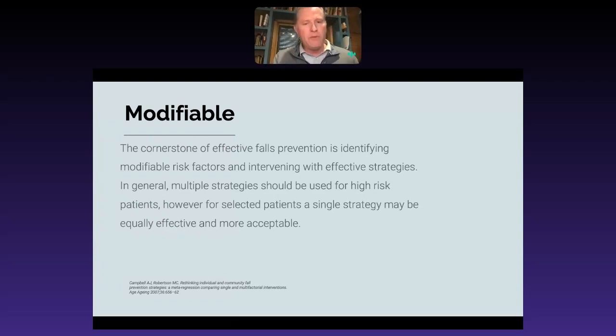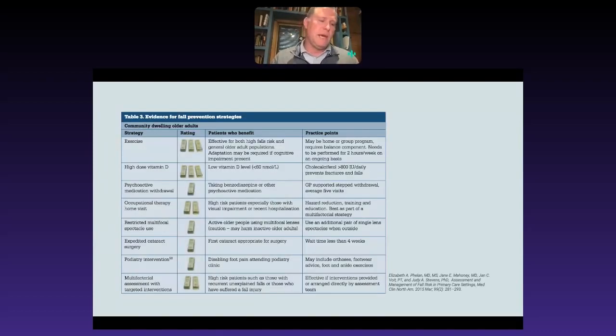Now, what we have to be careful about, and what I'll demonstrate here in just a second, is that when you use a brace for someone that's old, or someone that's a senior, or someone that has really bad neuropathy, I use the more balanced brace for 40-year-olds who can't feel their feet from their knees down. Those people are oftentimes the most grateful and the ones that benefit the most. But in many cases, these are seniors. We cannot put these people in heavy, stiff, and non-flexible devices. We have to make sure that they work and that they can bend their ankles and move in an appropriate way.